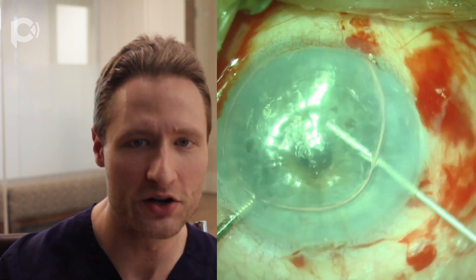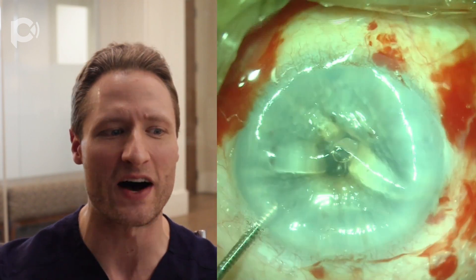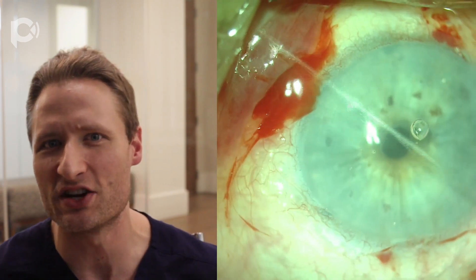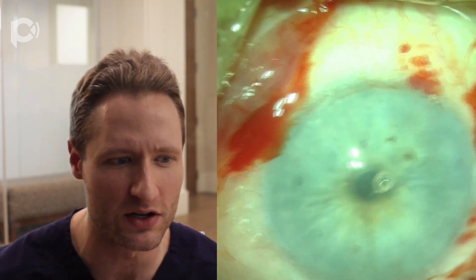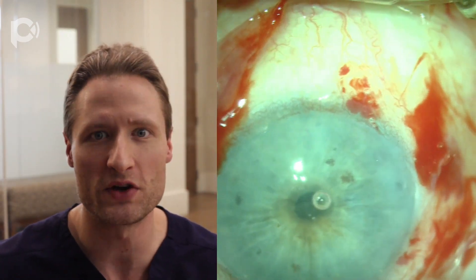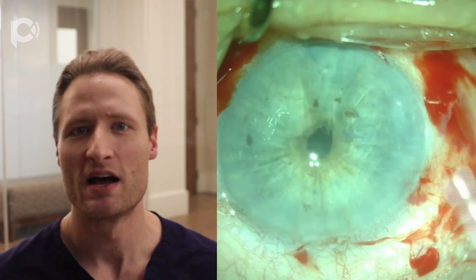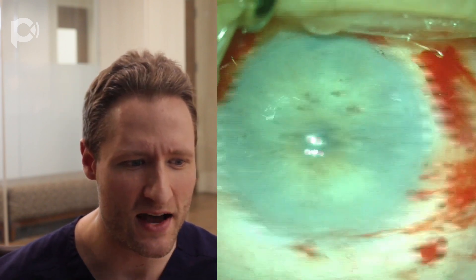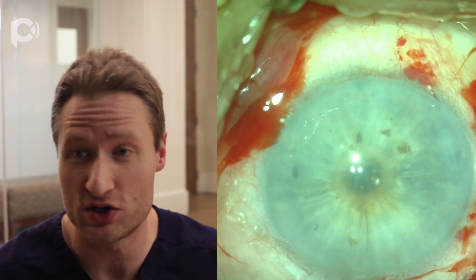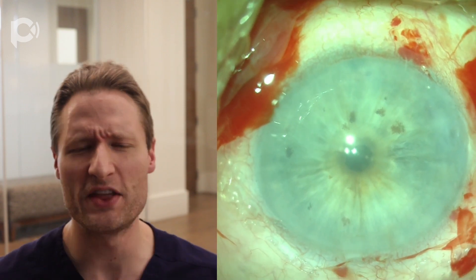I usually do the iridotomy not under air, but refill the anterior chamber with balanced salt solution, because that way I can see the iris vibrate and move. If you have the anterior chamber filled with air, you can't really see when you've engaged the iris, so you can't tell when you've made the iridotomy. Here we've made a very far peripheral iridotomy. I'm going to supplement the anesthesia with a little preservative-free lidocaine injected into the anterior chamber, and then inject the DMEK graft into the eye using a 2.4 millimeter clear corneal incision with our DORC glass injector.